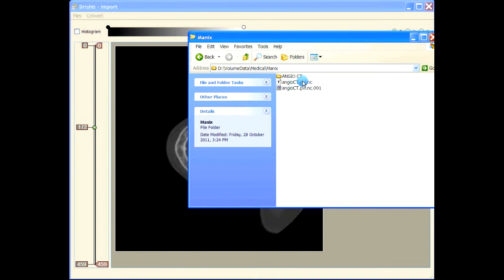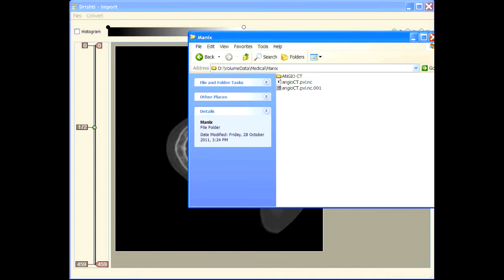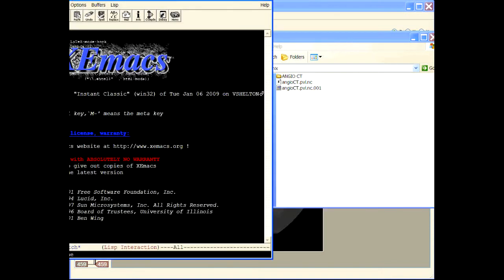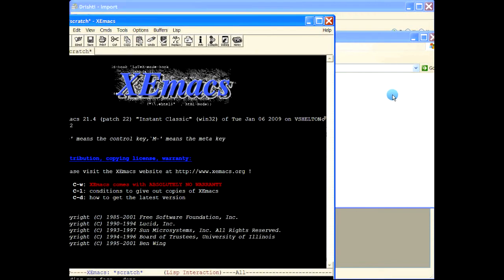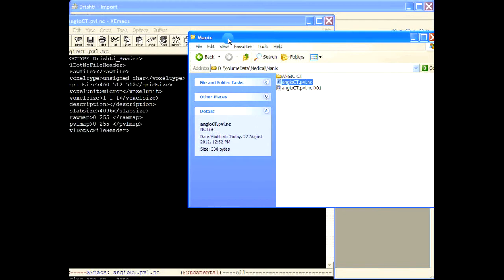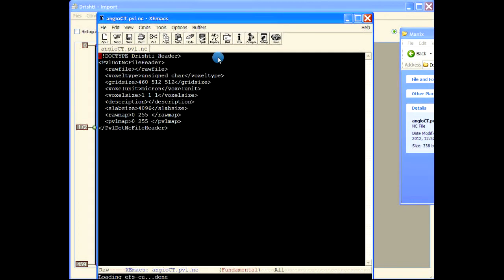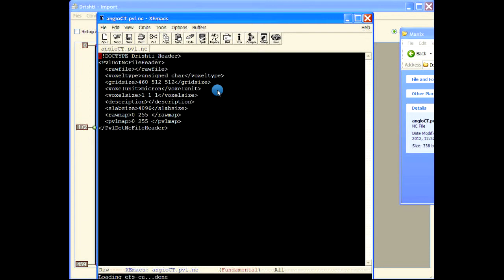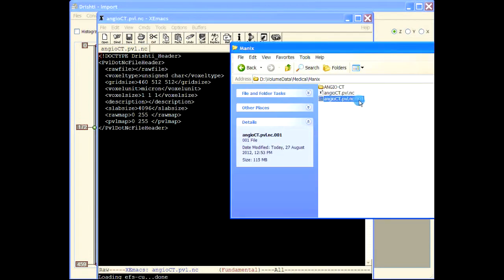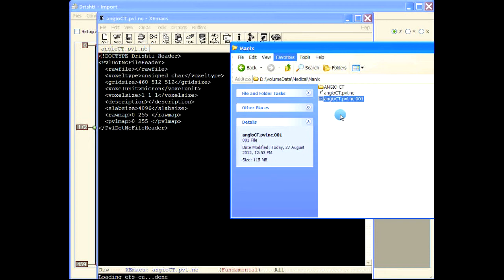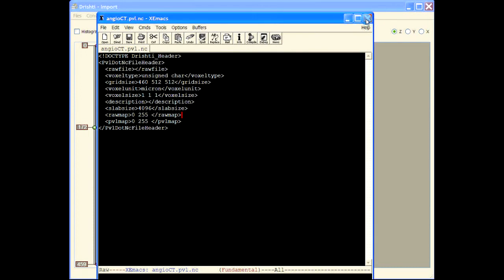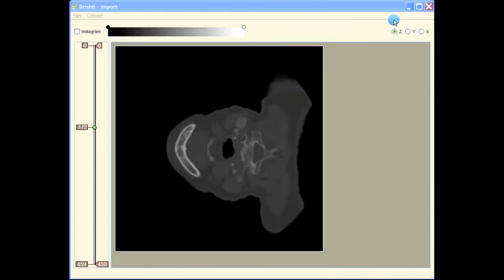These are the two files that were created. During the render we are just going to drag and drop this file. This is an XML file - let me show you how this looks. So it's just a text file and it lists all the information in your metadata here, and this extension is essentially a link to your raw data. So your raw data is really lying in this file here, 001, and this name of the file is a link to your raw data.